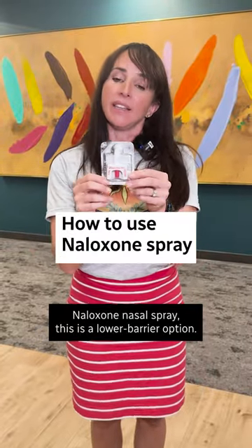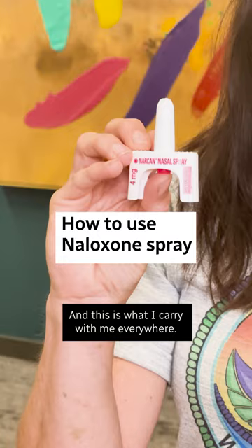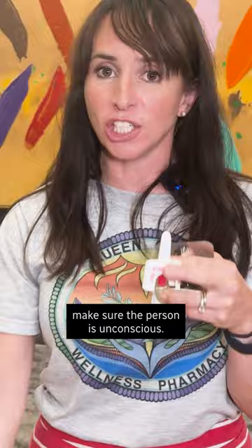The naloxone nasal spray. This is a lower barrier option and this is what I carry with me everywhere. You just open up the container like this. Make sure the person is unconscious — they can't wake up with a good pinch here, a good rub here.